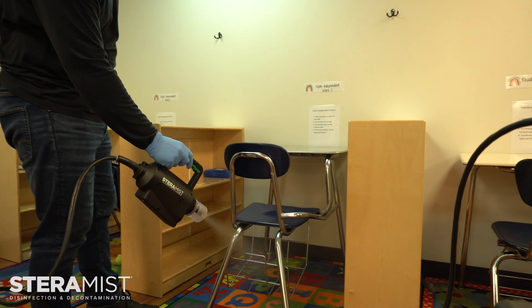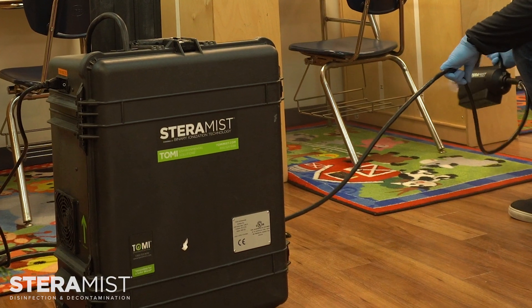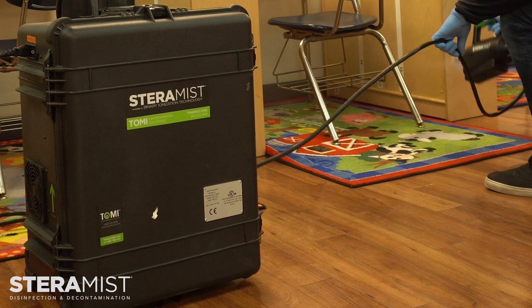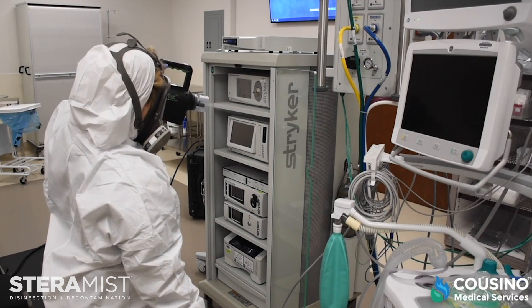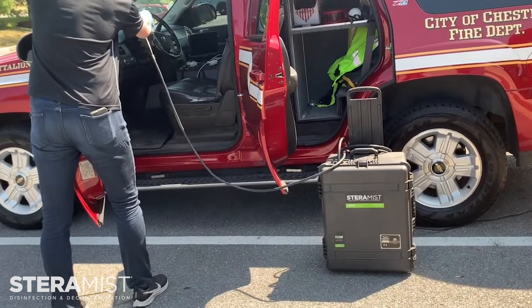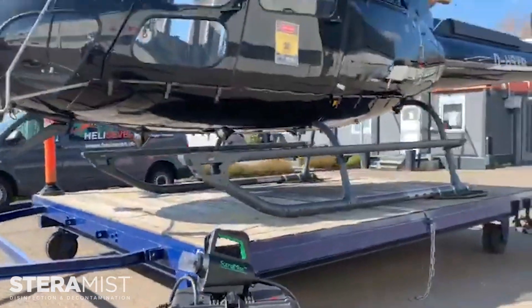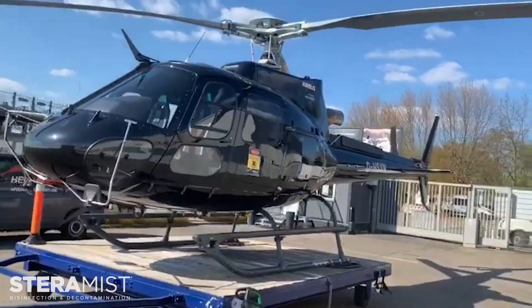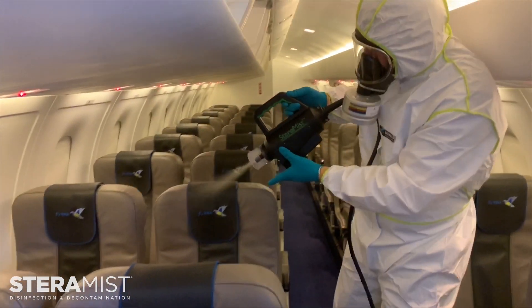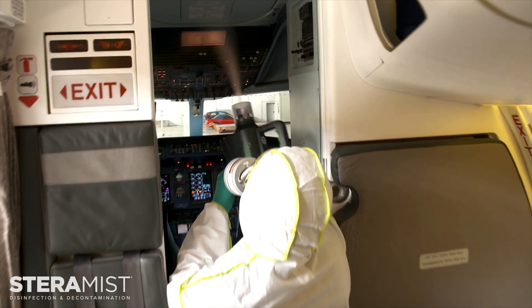The convenient 30-foot hose allows you to move freely in the space without having to worry about cumbersome equipment getting in the way. Our 7.8% bit solution is ready to efficiently disinfect schools, emergency vehicles, laboratories, healthcare facilities, and even sensitive instruments and avionics. The surface unit is ready to tackle any job easier than ever.